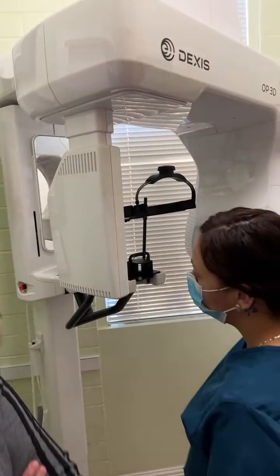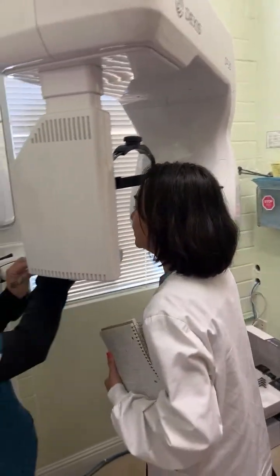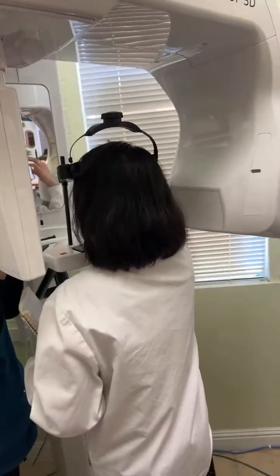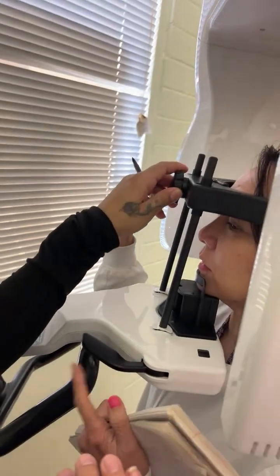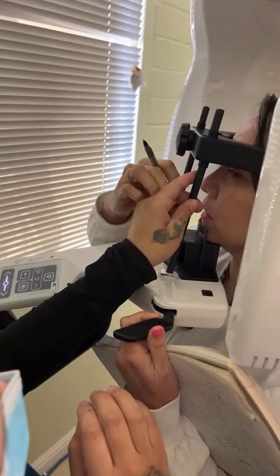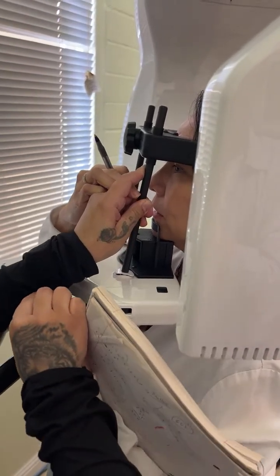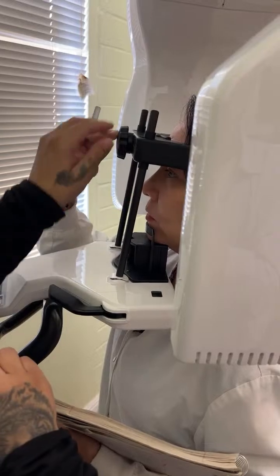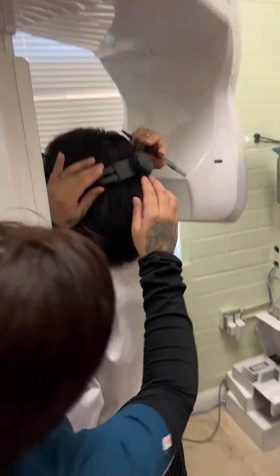Why don't you sit in so that she can try. Let me do it. First, you put this one parallel with my head first. You see that? And then unlock this one. One hand hold, one hand unlock, you understand? It rests just in my forehead. And then lock it. You see that? And then tie this one. It's not that hard. That's for the back. You need repetition. And then put it down. Got it. That's it. You got the idea.